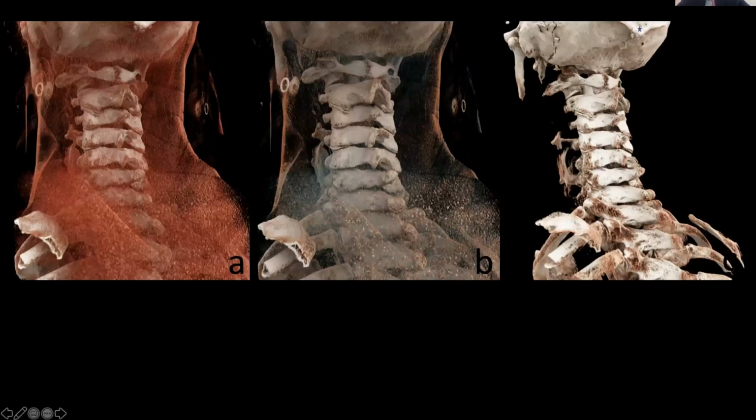I just throw that out there because what you'll probably see either now or over the next few years, a lot of vendors purporting to have technology that allows you to visualize structures directly over the skin, and in the majority of cases, that's actually not the case. There's actually a significant margin of error. The best algorithms that we've seen have been probably a minimum of 8 millimeters of error if you try to overlay digital information on soft tissue, particularly soft tissue where there's a lot of deformation in the course of a surgery. But anyway, that's a bit of a tangent.